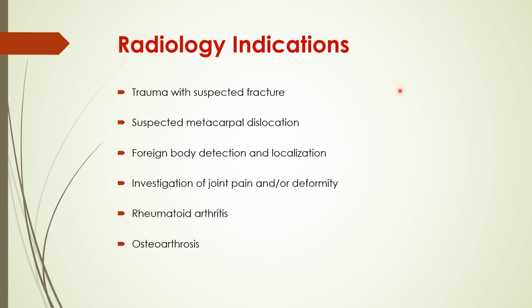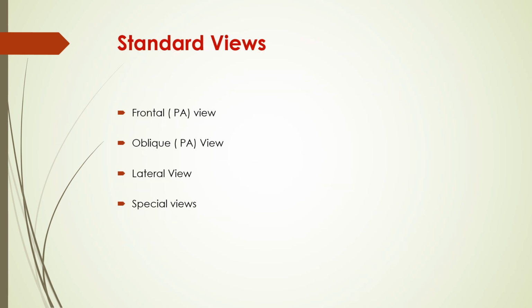So what are the indications of radiology? We all know: trauma with suspected fracture or dislocation, foreign body, or investigation into joint pain or deformity, rheumatoid arthritis or osteoarthritis. The standard views are the standard frontal PA view, oblique PA view, lateral views and special views.